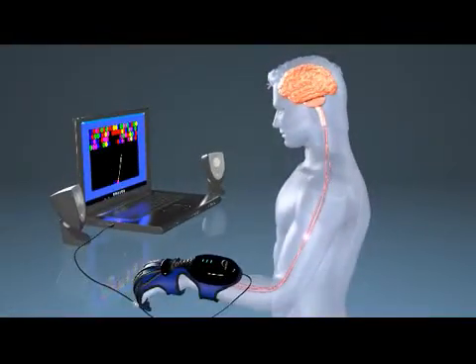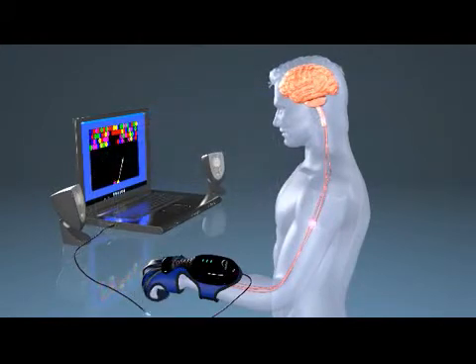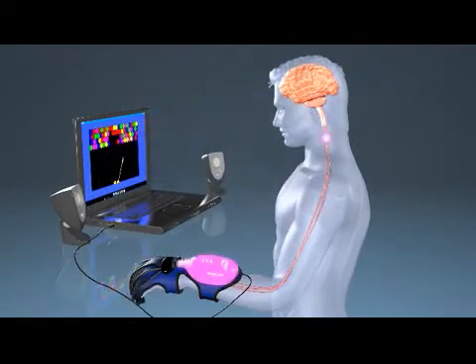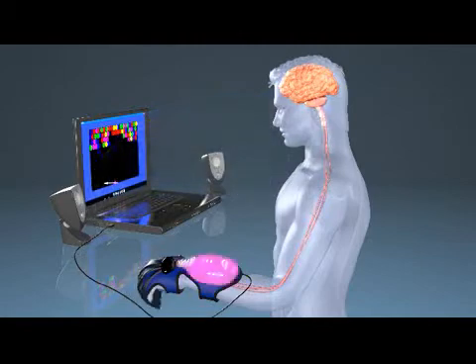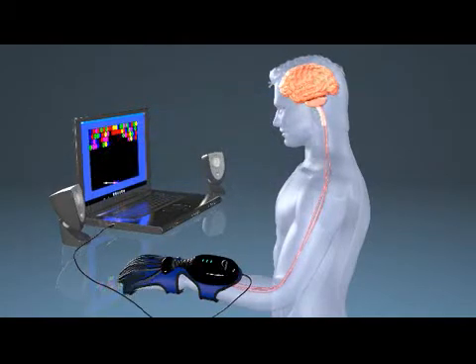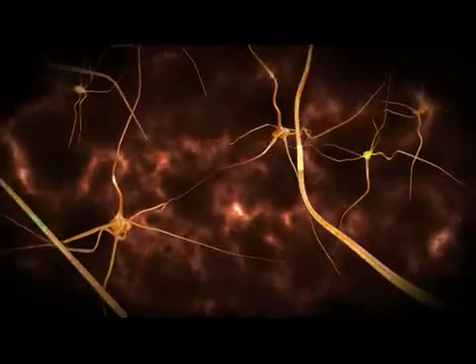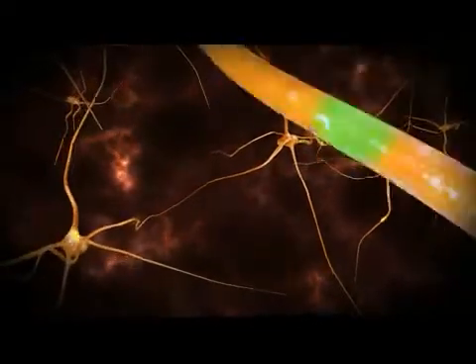The Hand Tutor glove records motion feedback. Sensors within the glove quantitatively measure the movement of the fingers and wrist. The motion information provides a continuous stream of feedback on range, speed, and quality of hand movements. This real-time audio and visual feedback teaches the patient how to move their hands again, which enables them to better perform functional tasks.